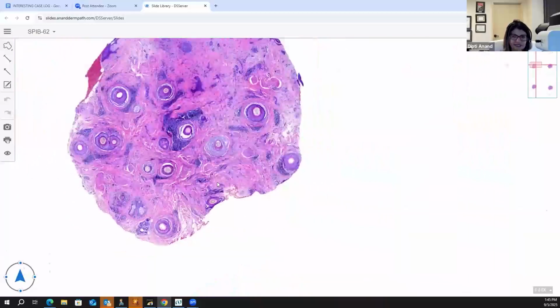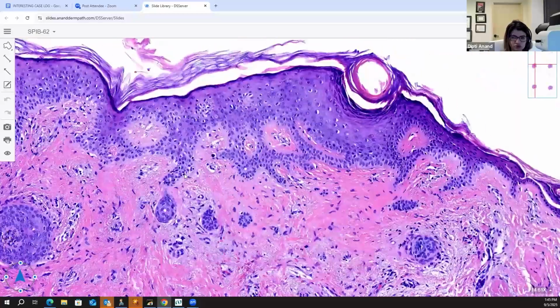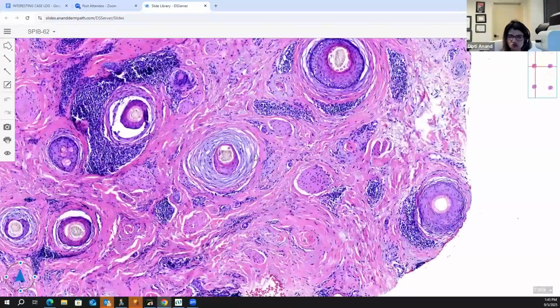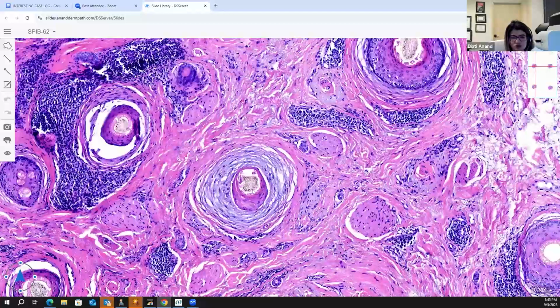Okay? And the reason it's not lupus is you see the overlying epi. Everything is normal except for where the follicle is attached, where you see a little bit of perifollicular fibrosis, but the rest of it is all normal. So because of that, it's not lupus. But I just want you to maybe take a screenshot of this or bury this in your head. This might actually also be the screenshot on my Dermpath page somewhere. Somebody did that. It was not me, but it is that diagnostic of LPP.